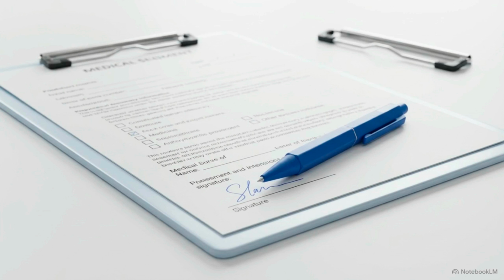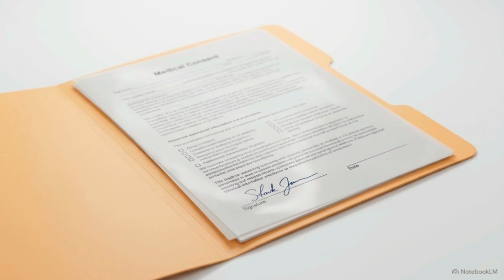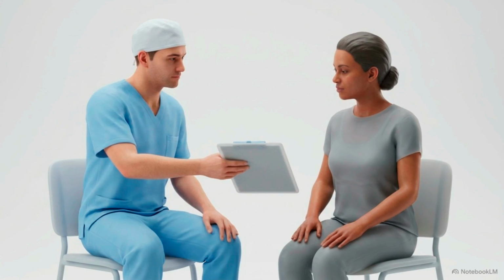Once they have read the materials, the donor must sign a written informed consent. This is a legal and ethical mandate, confirming they understand the risk of the procedure and their own responsibility in maintaining a clean blood supply.